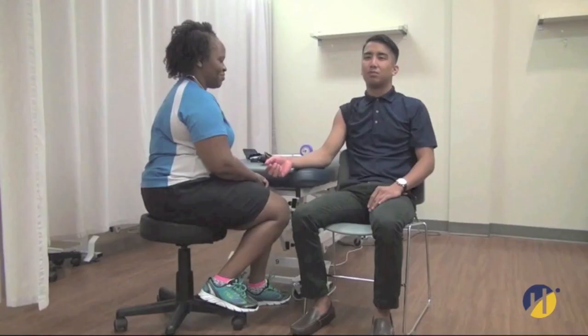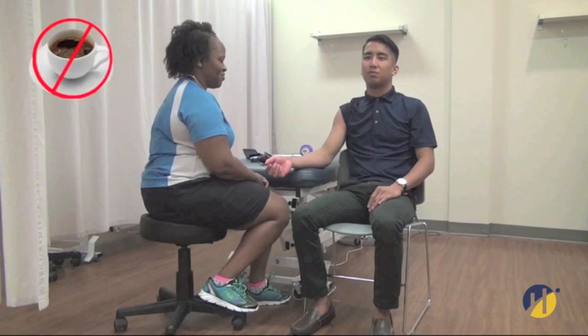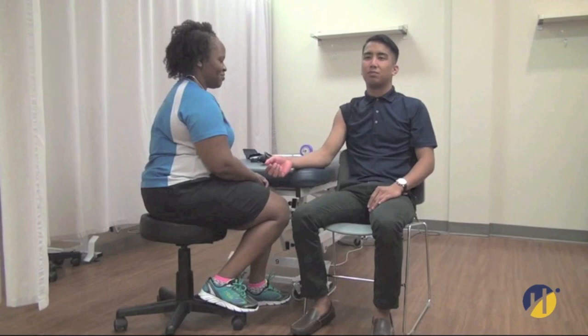Neither the patient nor the observer should talk during the measurement. There should be no smoking or nicotine for your patient 15 to 30 minutes prior to the blood pressure assessment. Also, there should be no caffeine consumed for your patient 1 hour prior to the blood pressure assessment.